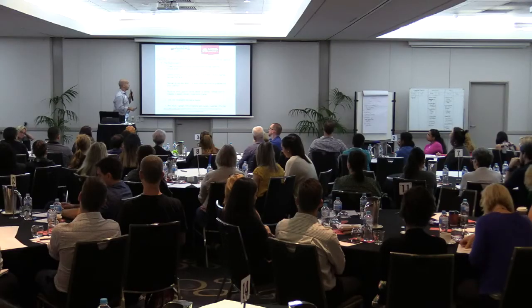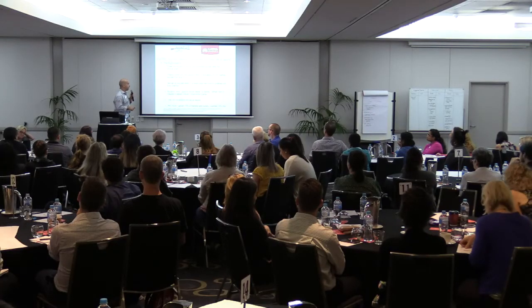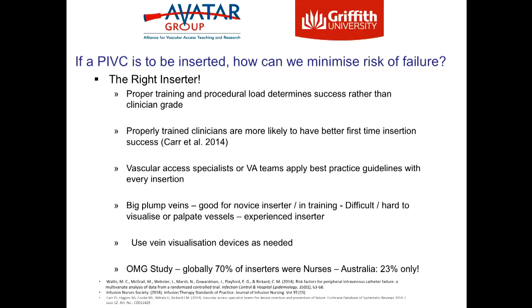When we look at the use of vascular access specialists and vascular access teams, they're the ones that can best apply the evidence. So if possible, having a vascular access team in your hospital is probably the best go. Using vein visualization devices as needed is also important.